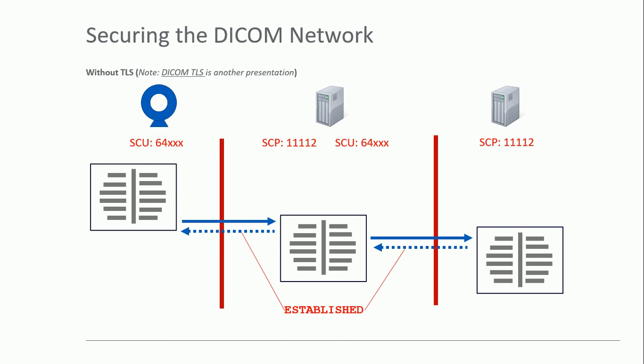One of the things that makes this a very secure architecture is that in order for traffic to traverse from our protected hospital network to get to a modality, which is isolated, as close to air-gapped as we can get, that can't happen, right? That traffic would have to go through that firewall to our DICOM router and then get from there to the other network, right? So this is a good mechanism. This is a good way to set up a DICOM network.